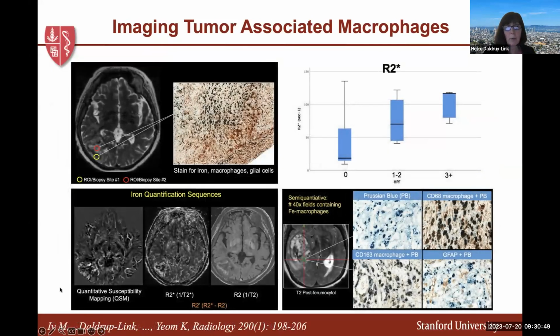This was confirmed by one of my colleagues, Michael. Michael infused iron oxide nanoparticles into patients with brain tumors, then did an MRI 24 hours later, and these patients underwent either a biopsy of their tumor or resection of their tumor the day after the MRI.